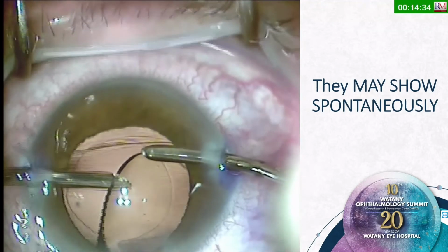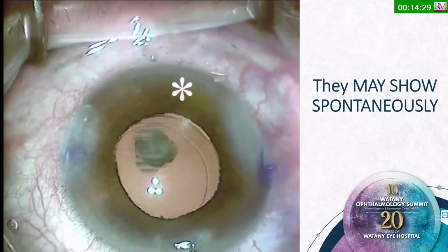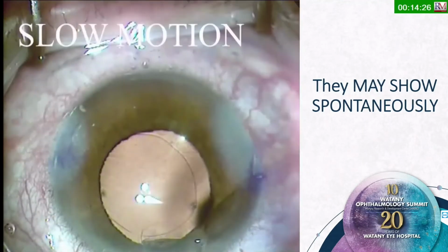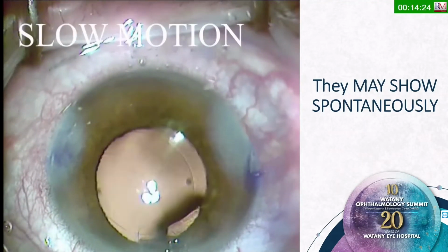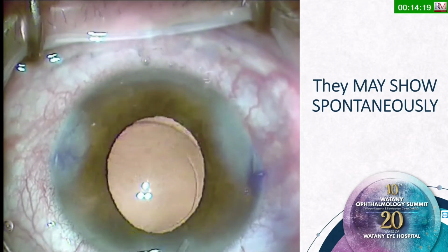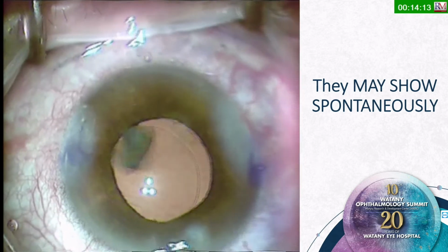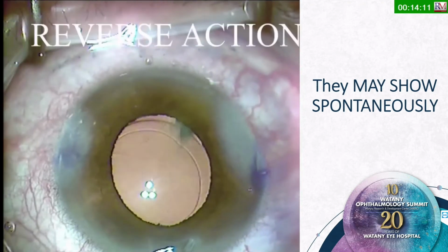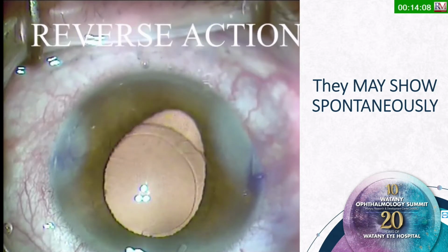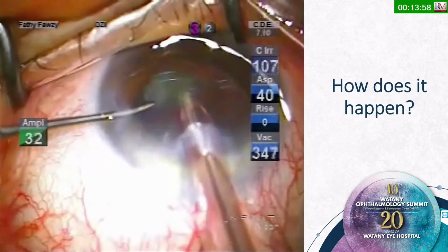Sometimes when you are enjoying the end of your straightforward, beautiful surgery and hearing the kettle boiling and preparing yourself to have a cup of tea, then when you do the hydrodissection, the stromal hydration, you can see it now in slow motion coming, and that disappeared into the sulcus, and this is in a reverse action. This big fragment has actually gone and hid into the sulcus. You always ask yourself, how did that happen? Because actually it looked to me like a straightforward case.